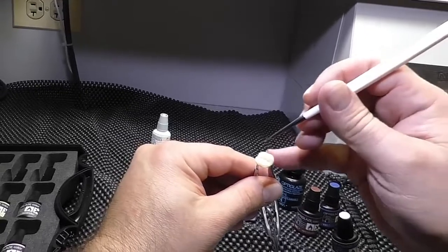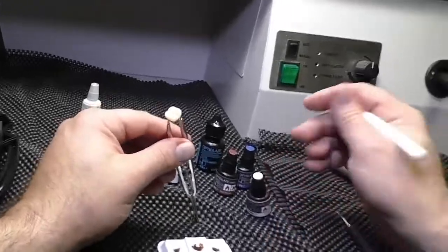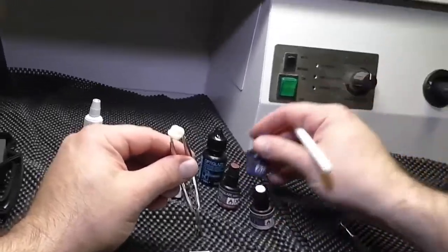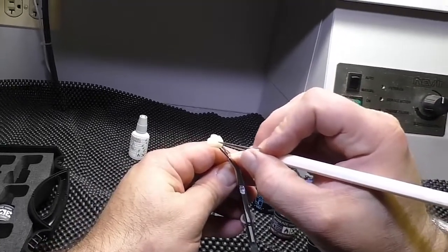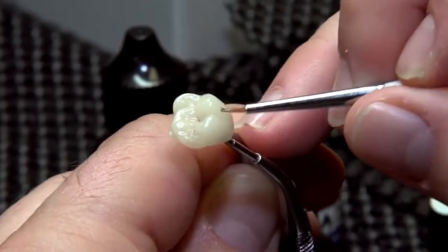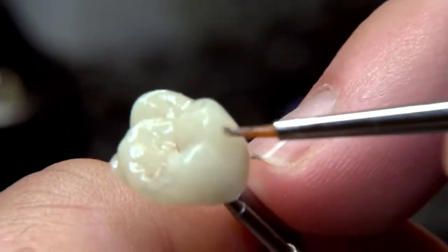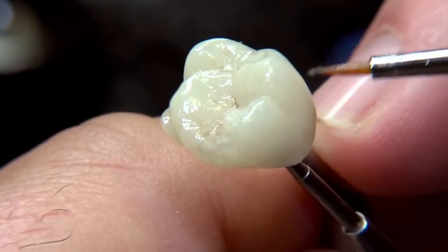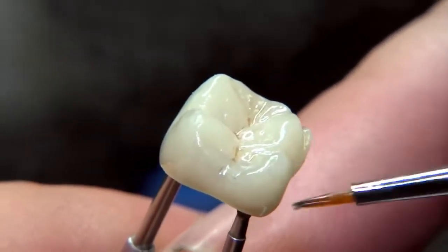After applying the grays on each mesial and distal marginal ridge, we can take the blue color — again, very gently, otherwise it gets way too intense — and just add some enamel effects to the cusps. Once we finish that, we go ahead and light cure again for a few seconds.